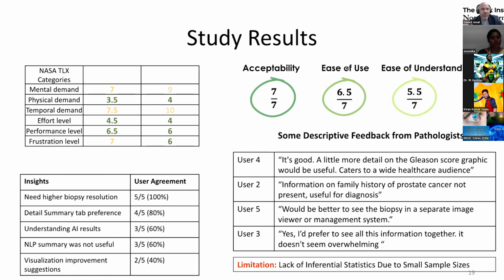The reason behind this study is that we want to improve our developed tool to be more useful, more acceptable, and more understandable by the pathologists, and also to be enriched by the review feedback that they provided, for example, the history of prostate cancer. We worked with pathologists on developing these models. We have collaborators who are pathologists, but when pathologists take a survey like the ones that we provided, they provide more thorough and more informative feedback.